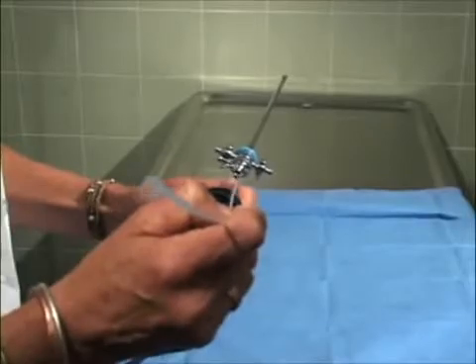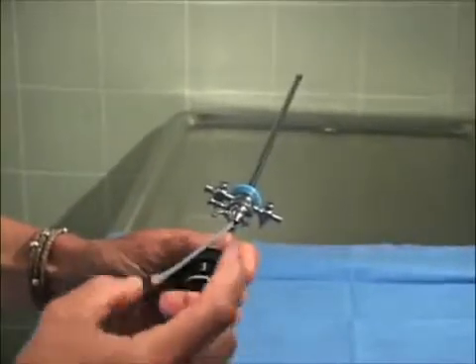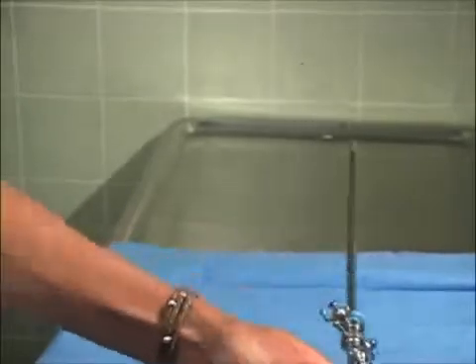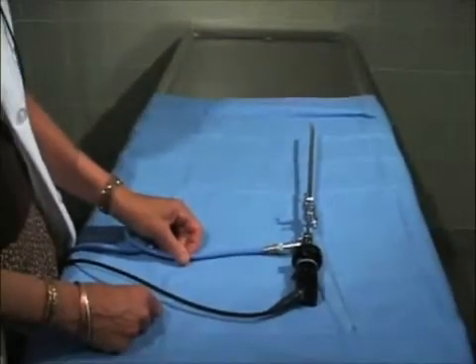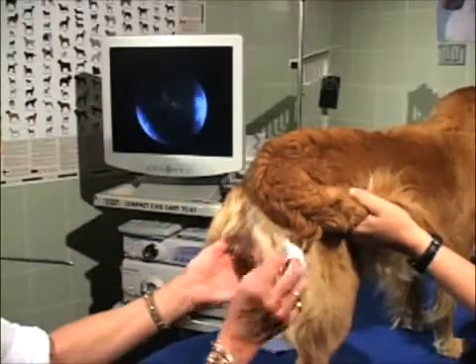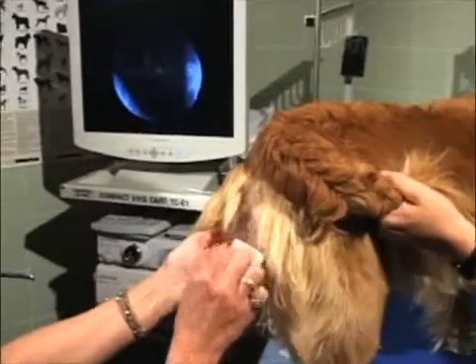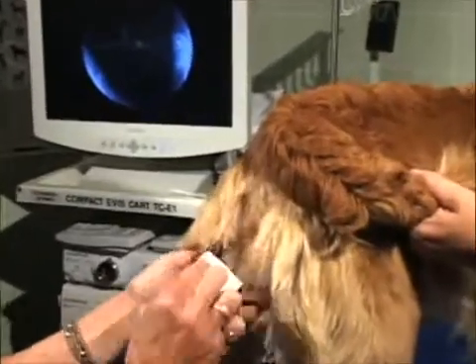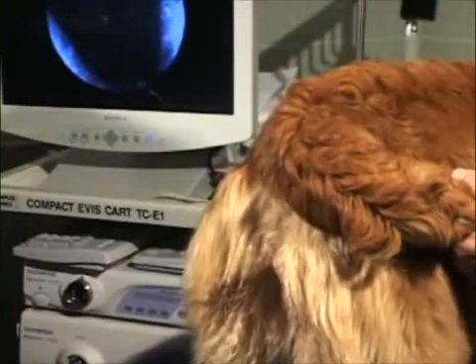The scope accommodates an 8-French catheter. We swab the external vulva with gauze moistened with isopropyl alcohol to remove external fluids and minimize interference with the lens.